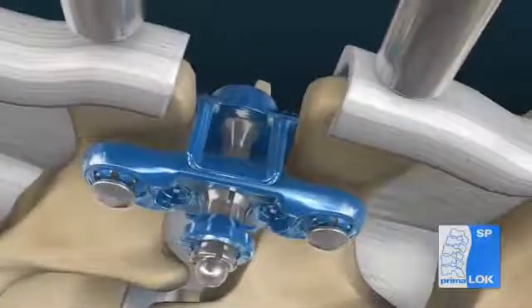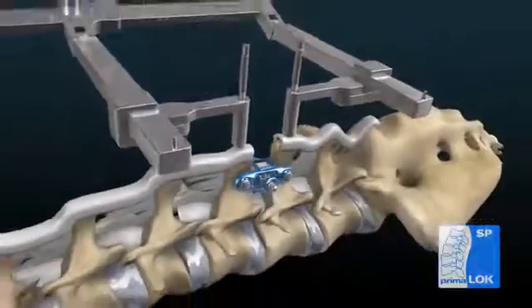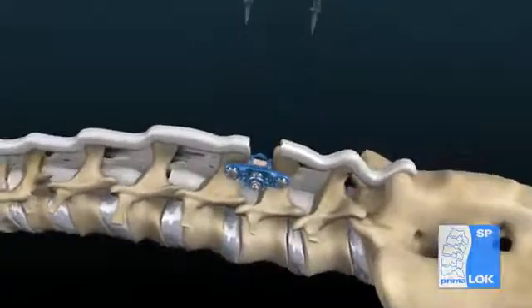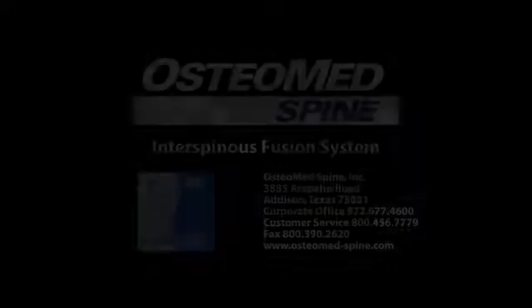If desired, pack graft material into the graft space. Release distraction and remove the distractor pins.